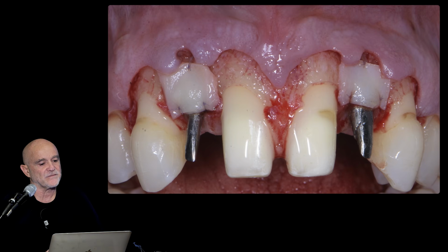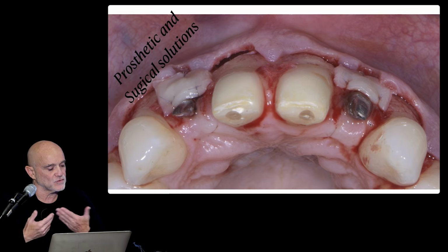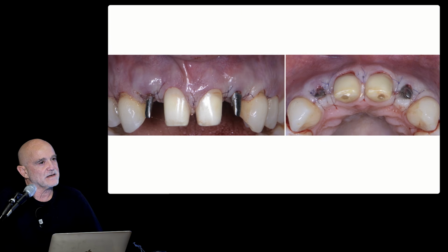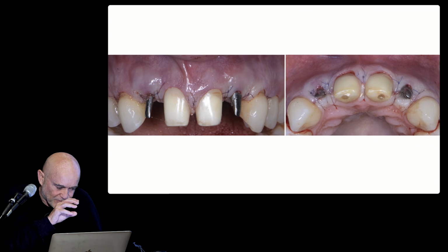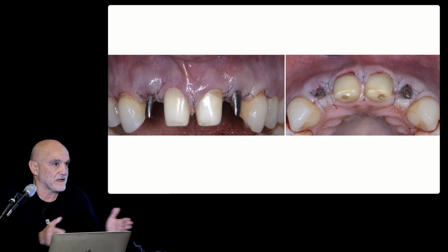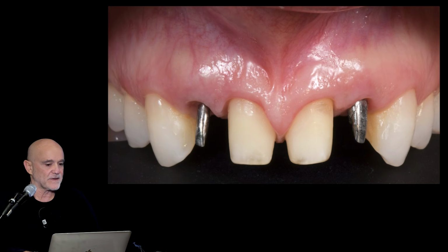The connective tissue graft is extended at the base of the papilla to promote papilla growth, but now we have to cover. And how can we cover? We extend this epithelialization toward the palatal aspect, and we take advantage of the increased length of the surgical papilla during the incision to make everything heal by first intention. So there are surgical tips and tricks that allow you to overcome the problem of the proximity, provided we work prosthetically to create enough space between the natural abutment and the implant.